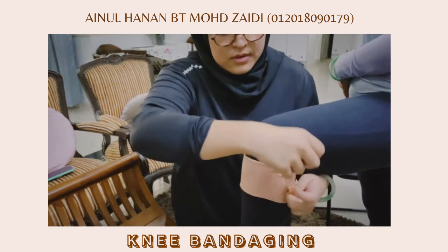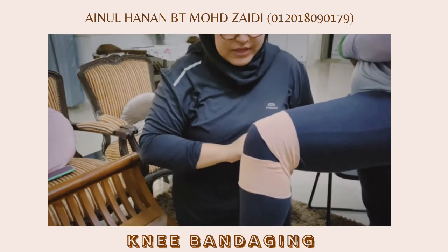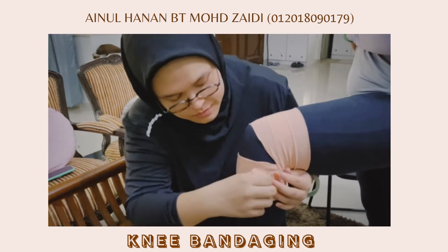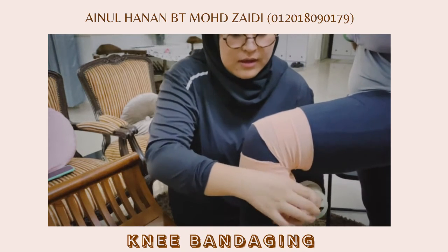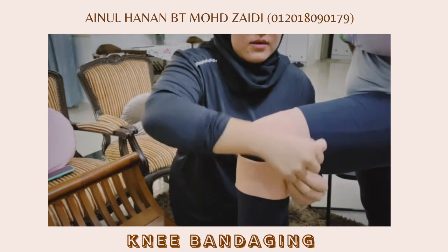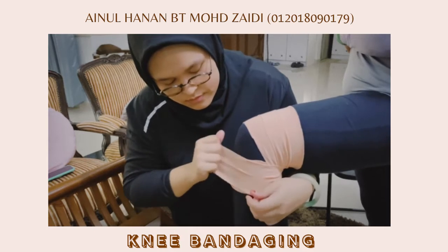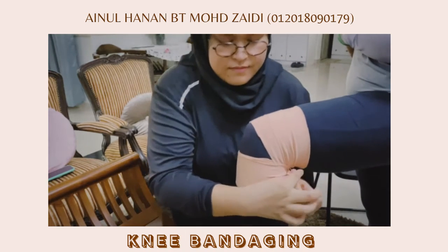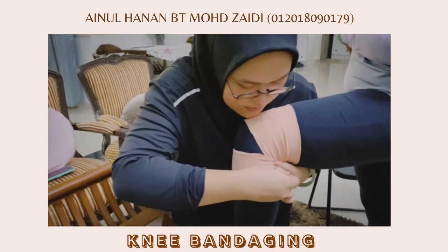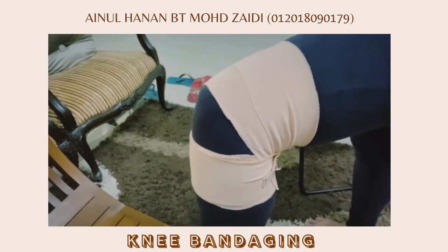and then cross up here right above the knee joint, like this, right above the knee, and then wrap around another time, and then cross back down to the calf area, and then up again to the knee, right above the knee, another one, and then cross down again to the calf, and then secure the bandage by using a pin, like this. And the end result should look like this.